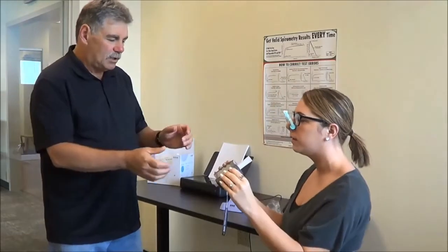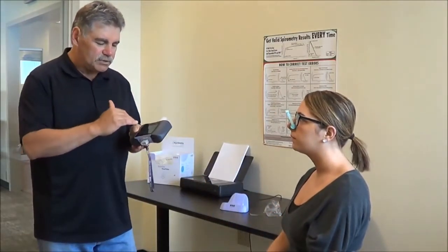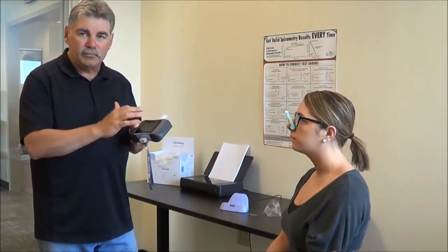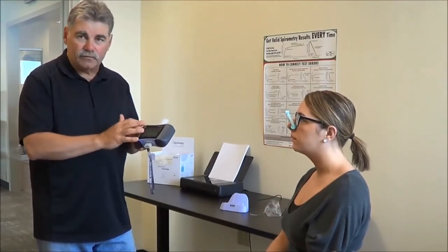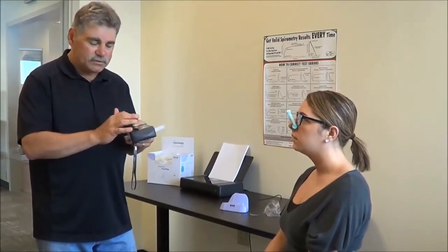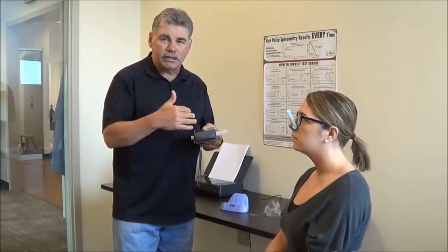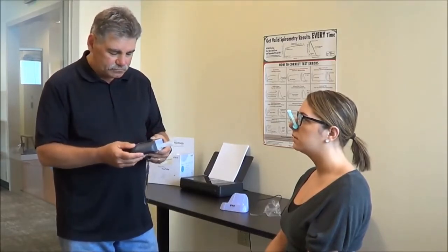Great job. Now, on the EasyOne Air, while Tina was blowing, I can see a flow volume and a volume time curve. As a technician, it's very useful for me to see the shape of those curves as she is blowing. So I am positioned in a way that I can see those curves while she's blowing to aid me in seeing the quality of the test that just occurred.